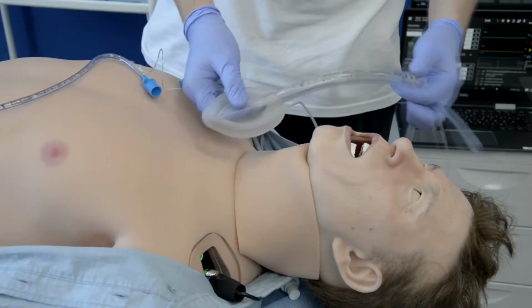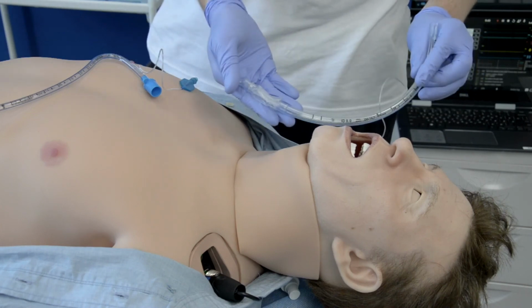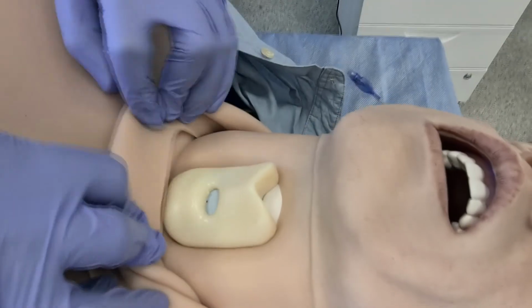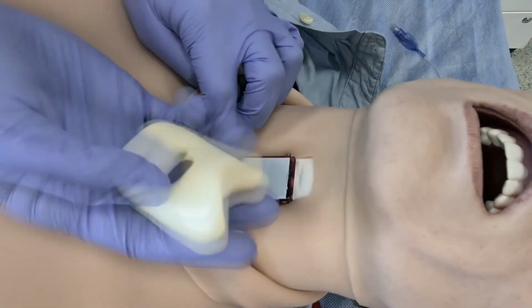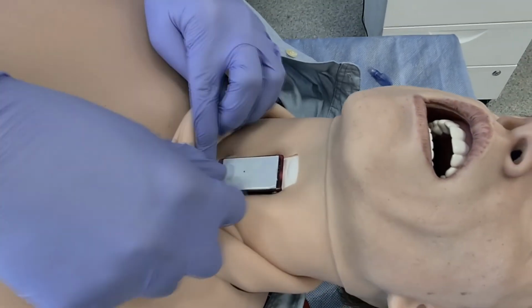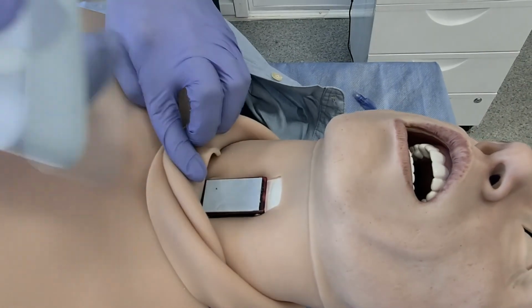Leo supports most types of supraglottic devices, including LMAs, ET tubes, size 6 to 8, NT tubes, and combi tubes. We try to minimize or simplify use of consumables with smart solutions in order to make it easy and effective for your daily training workflow. For cricothyrotomy, we use soft double-sided sticky tape that is an inexpensive and effective solution.